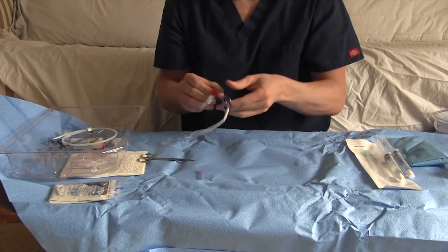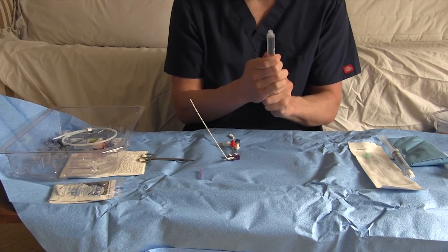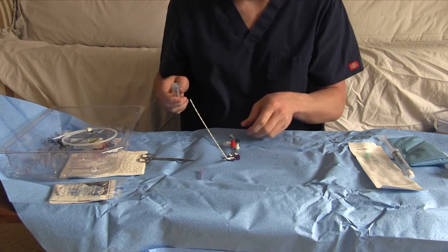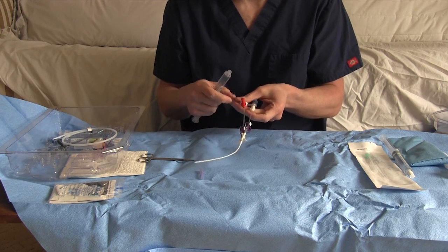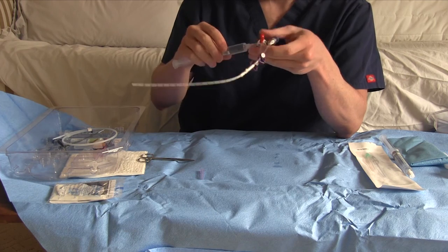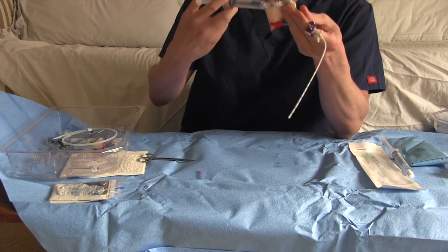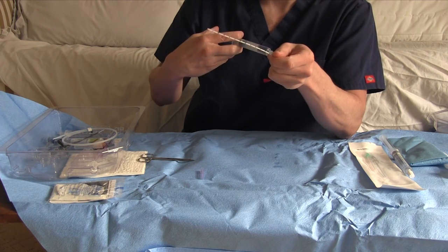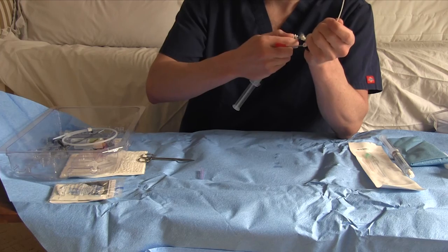All right, the next thing to do is flush the midline because you don't want air in there, because there's no wire blocking that air. Plus, this gives you the opportunity to actually push and pull saline if you think there's a clot at the tip and you're not getting good return. So the one with the wire in it gets flushed out of the side port right here. So I'm going to just flush that bad boy. There we go. And then lock the side port.